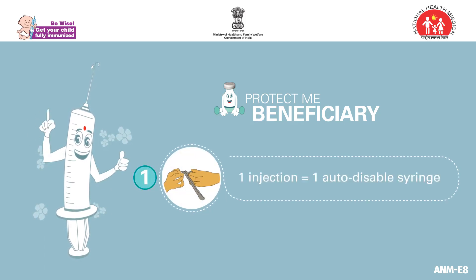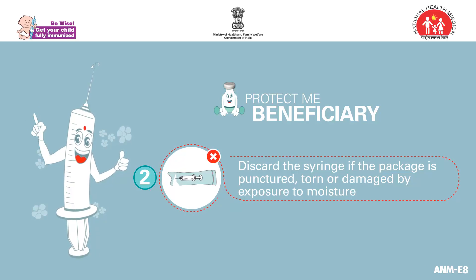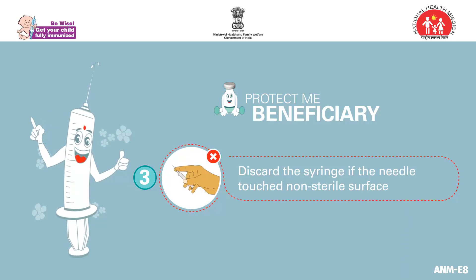Remember, use one auto-disabled syringe only for one injection. If the package is punctured, torn, or damaged by exposure to moisture, or if the needle has touched a non-sterile surface, then discard the syringe.